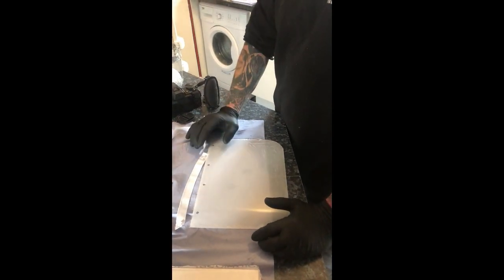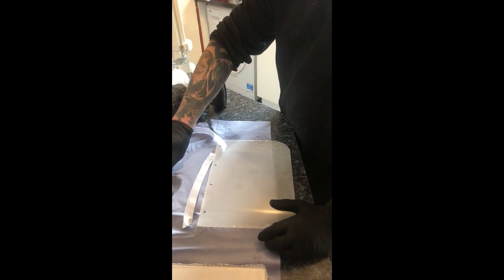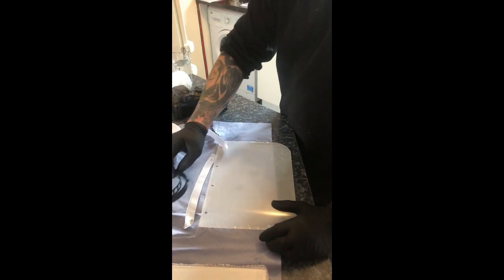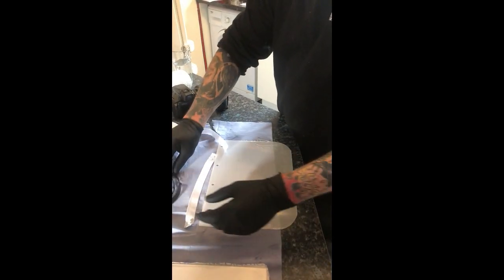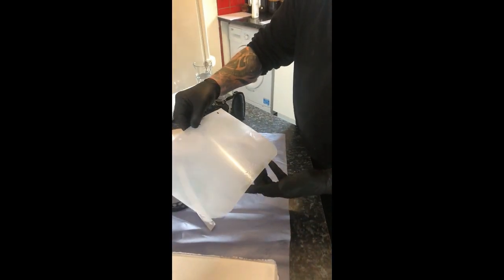Hi Dr. Lowe, just a quick demo of building these masks that we're going to supply you. We're supplying them in kit form. You've got your band which is flexible, you've got your elastic and you've got your 0.5mm poly sheet.